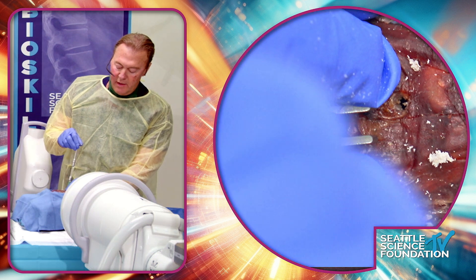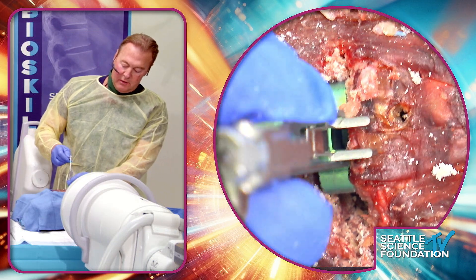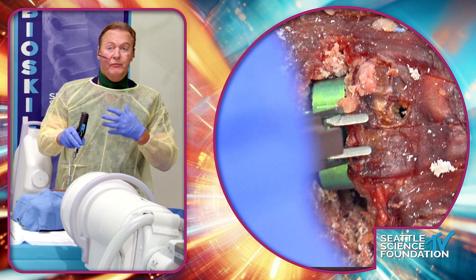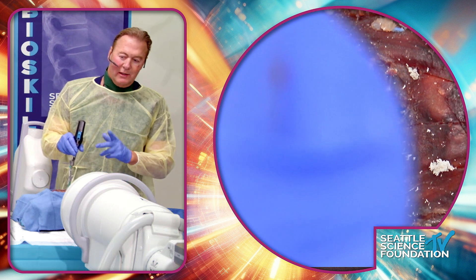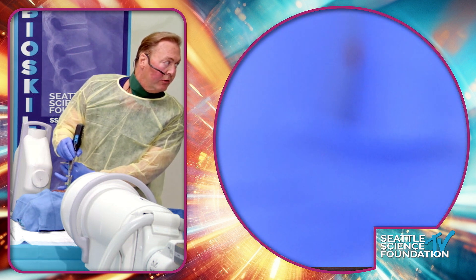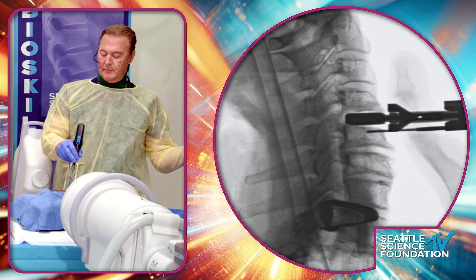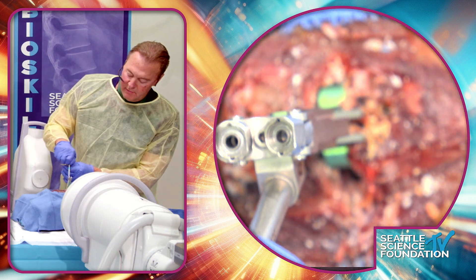Once you have your trial in, you can make your keel cuts — a size six cut. The bone may be very sclerotic if they've had prior fusions. If you want to revise to an SK, the chisel may deviate on sclerotic bone and you may get missed cuts, but because you're actually drilling you can see where you want to be. Check fluoro — this must not be down all the way. Reset and redrill — shoot the fluoro, there we go, better.